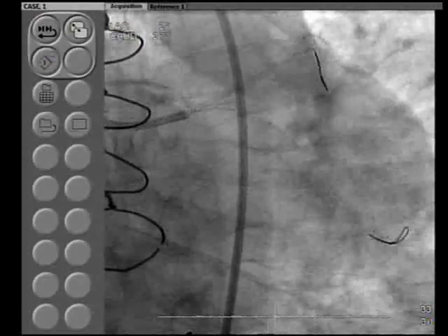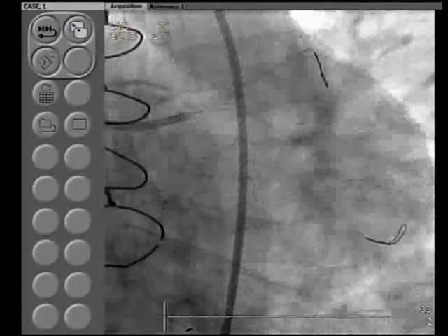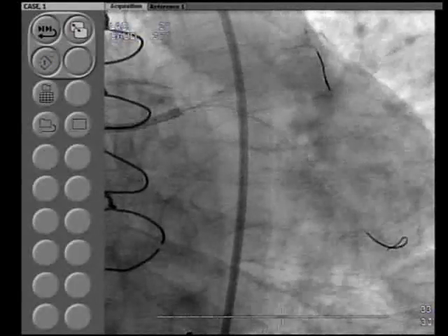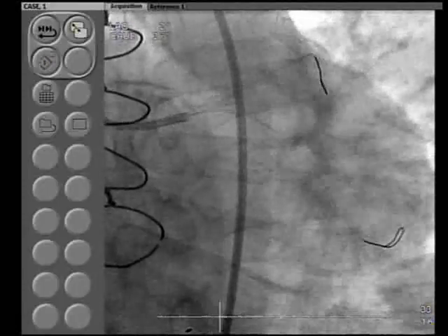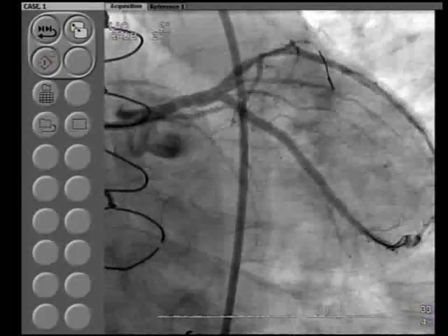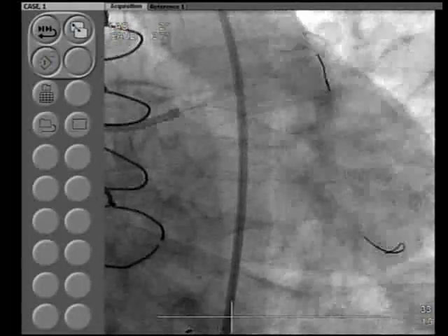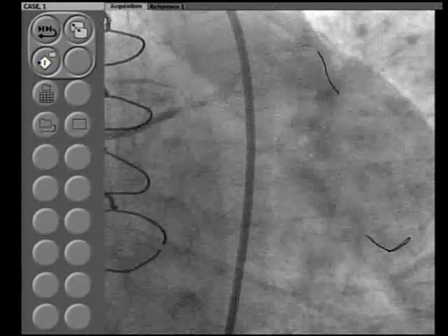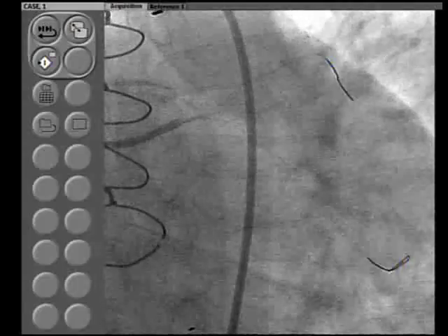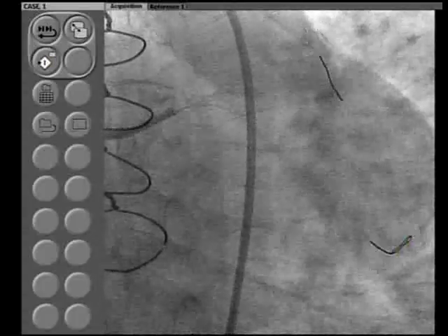And we'll now be on the IVUS. From all practical purposes, we are done. But just to emphasize, since this is an IVUS guided strategy, not only the stenting, we did a pre-stent deployment, and now, of course, at the carina of the bifurcation, we just need to see how it is. If we require a re-expansion of any portion of that bifurcation, we need to use two non-compliant balloons of similar length. The length should be similar. And then, of course, you can go to high pressure, whatever is required.